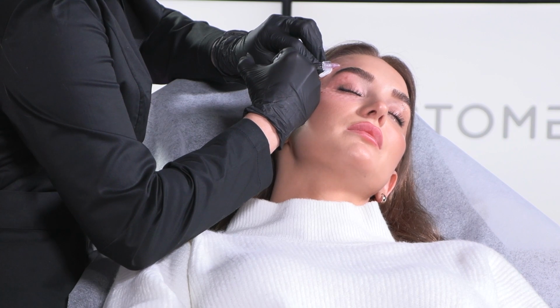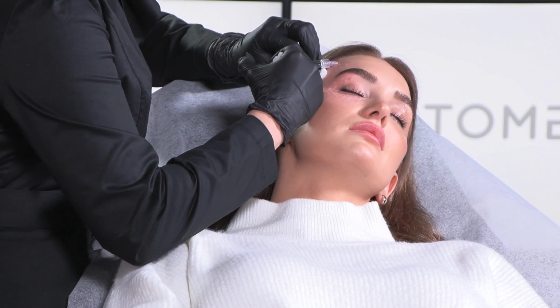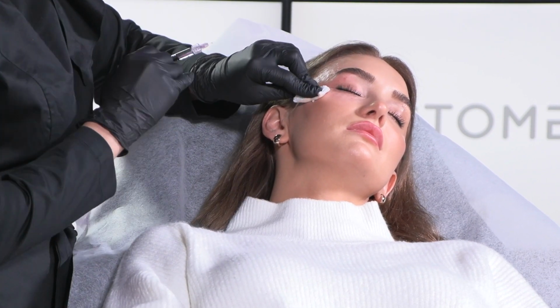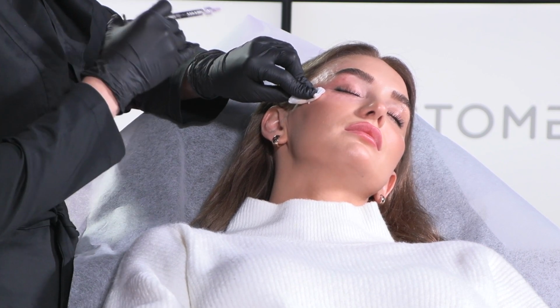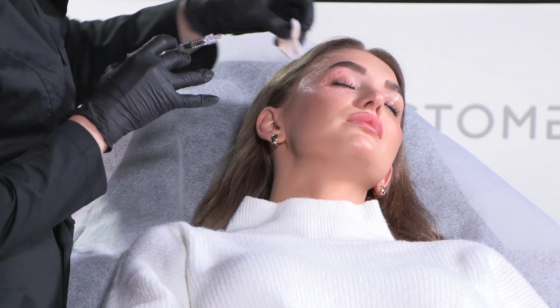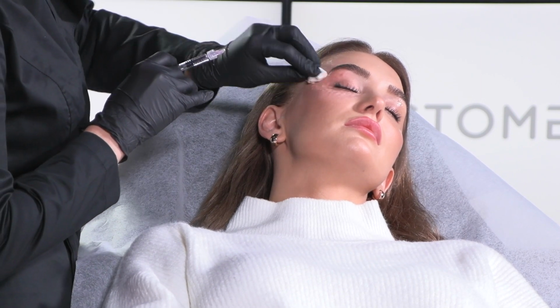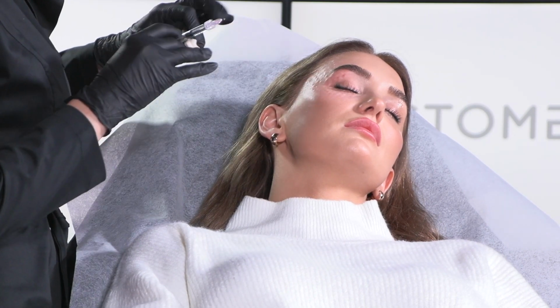Is it approximately 5 millimeters between every injection point, or how? Yes, kind of 5. I like to do more injections, but very small doses of the product, because I want to mainly integrate the product everywhere. It's spreading, of course, but I'm not a fan of big papules that make the patient suffer.